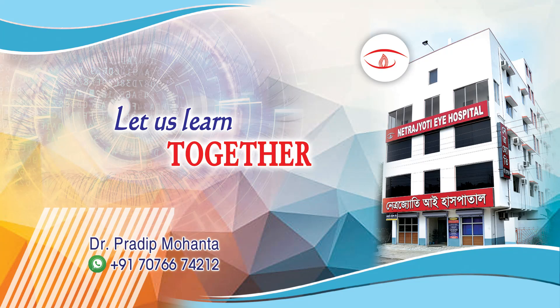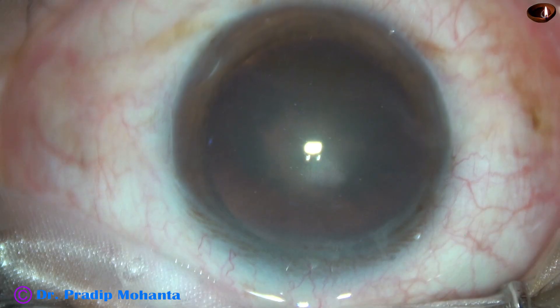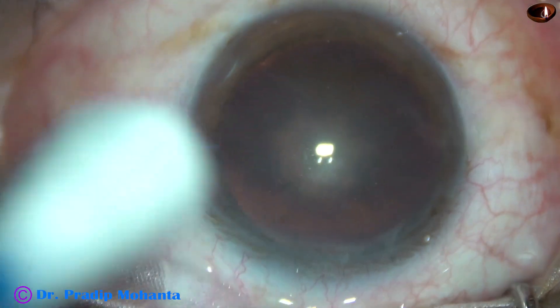Friends, welcome to my workplace at Ranaghat, West Bengal, India. This is a posterior subcapsular cataract with a very soft nucleus. Let us observe this surgery.